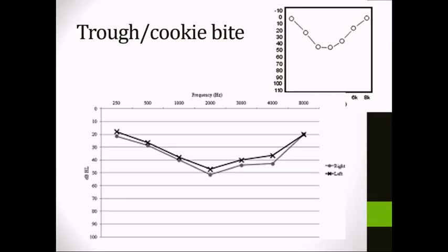So by now, at this point, you should be able to look at an audiogram that has pure tone air conduction thresholds marked on it, calculate pure tone average, classify the degree of hearing loss, describe it in terms of degree from best to worst, and also describe the configuration of the hearing loss. That's where, after the slides, you should really be at this point.